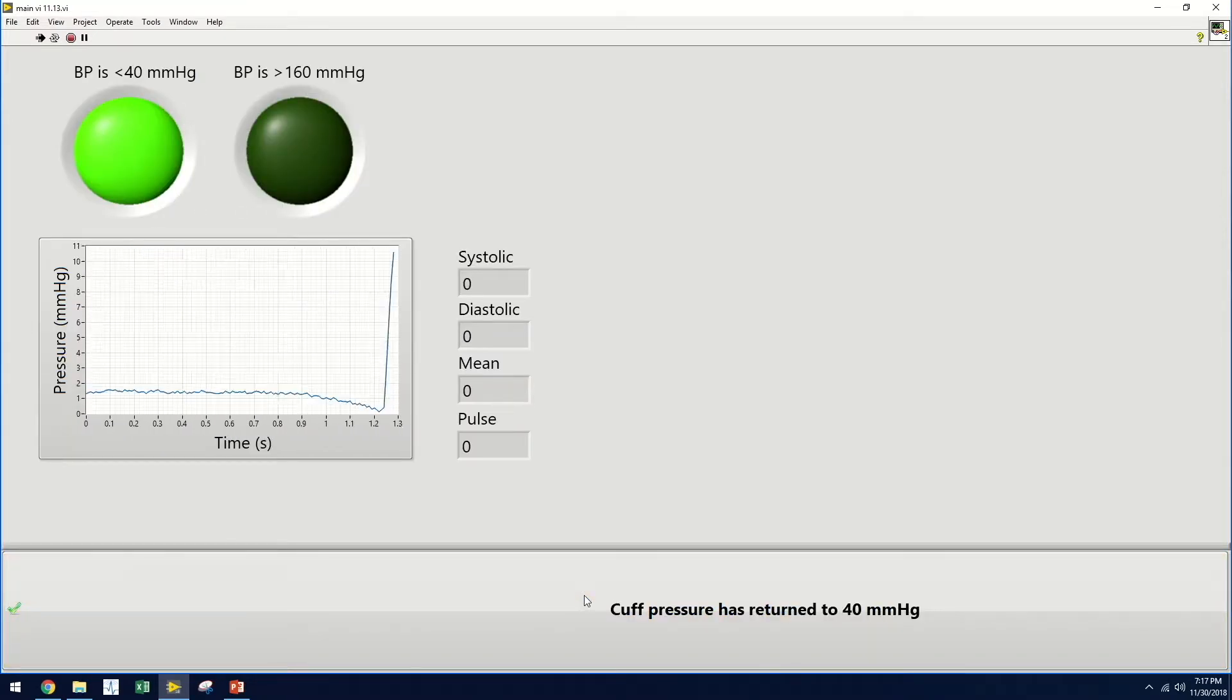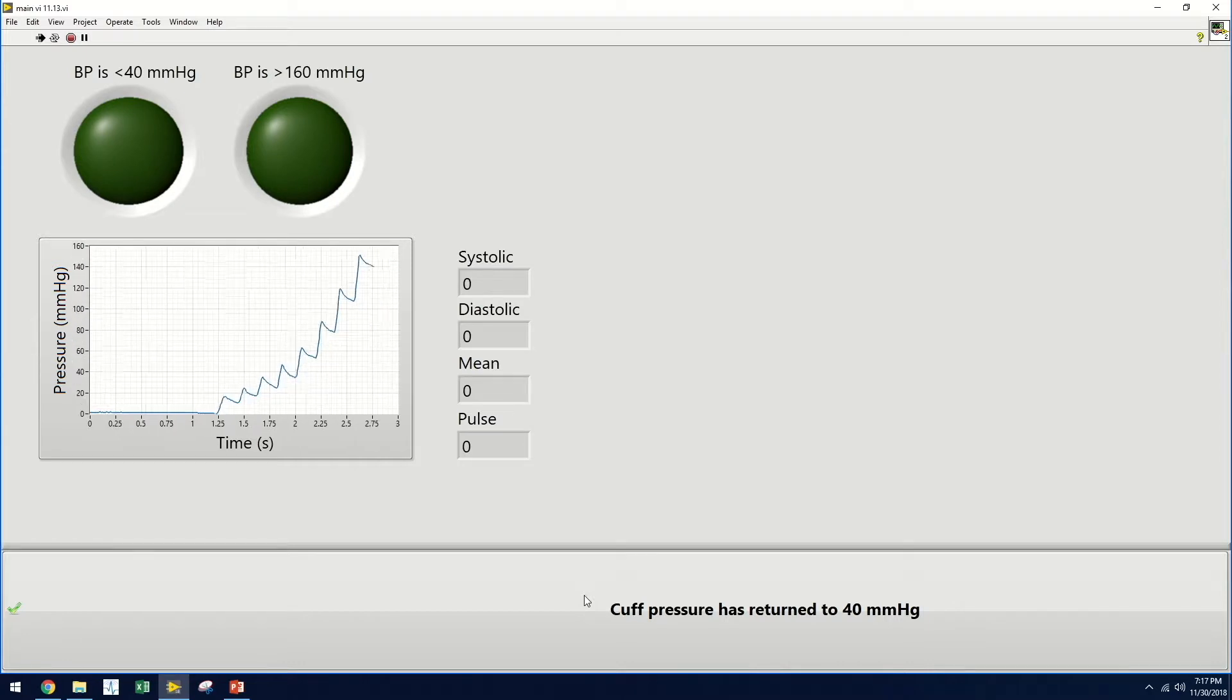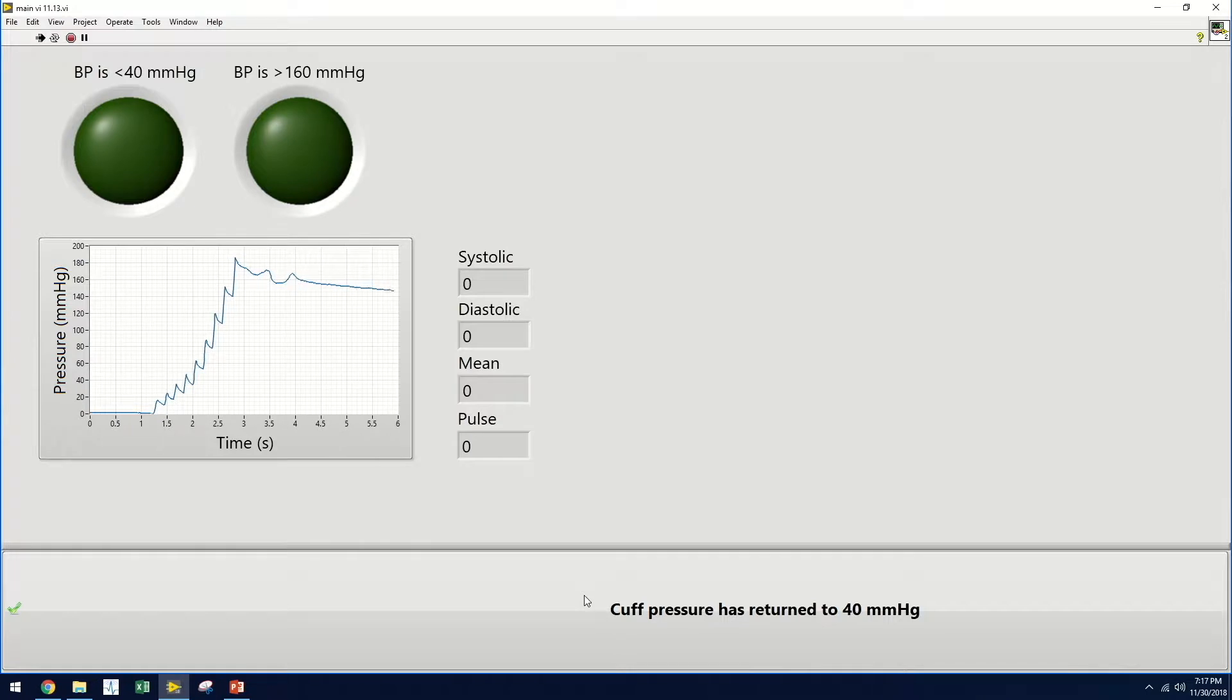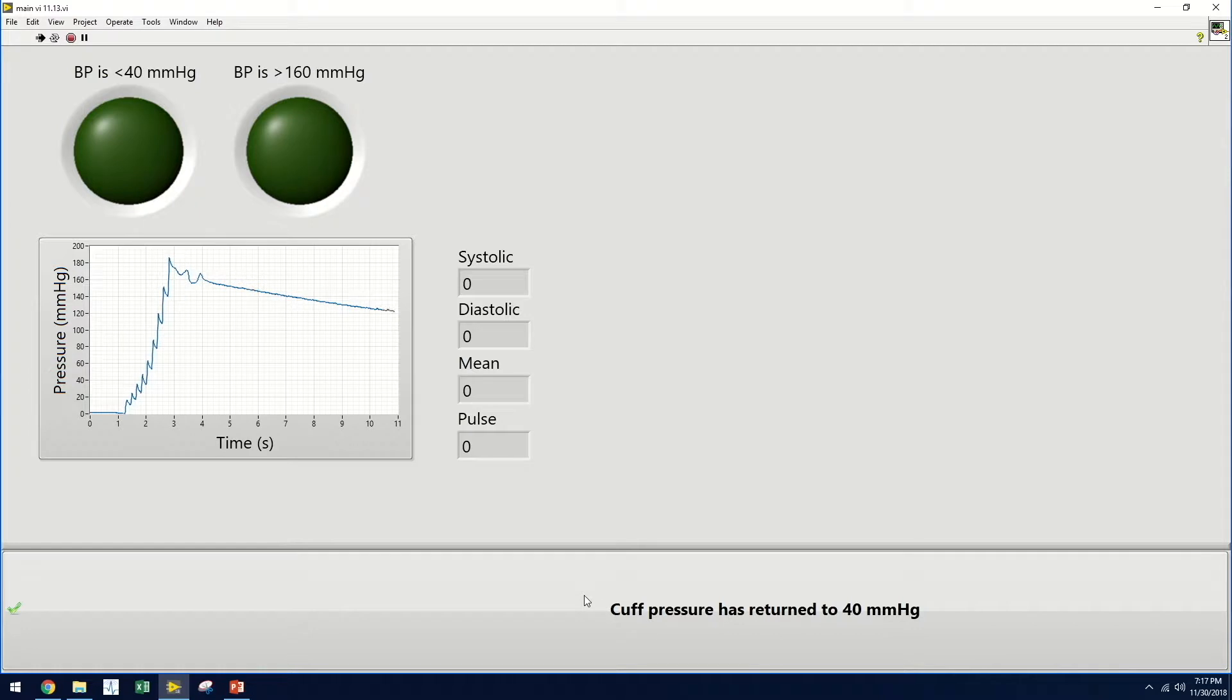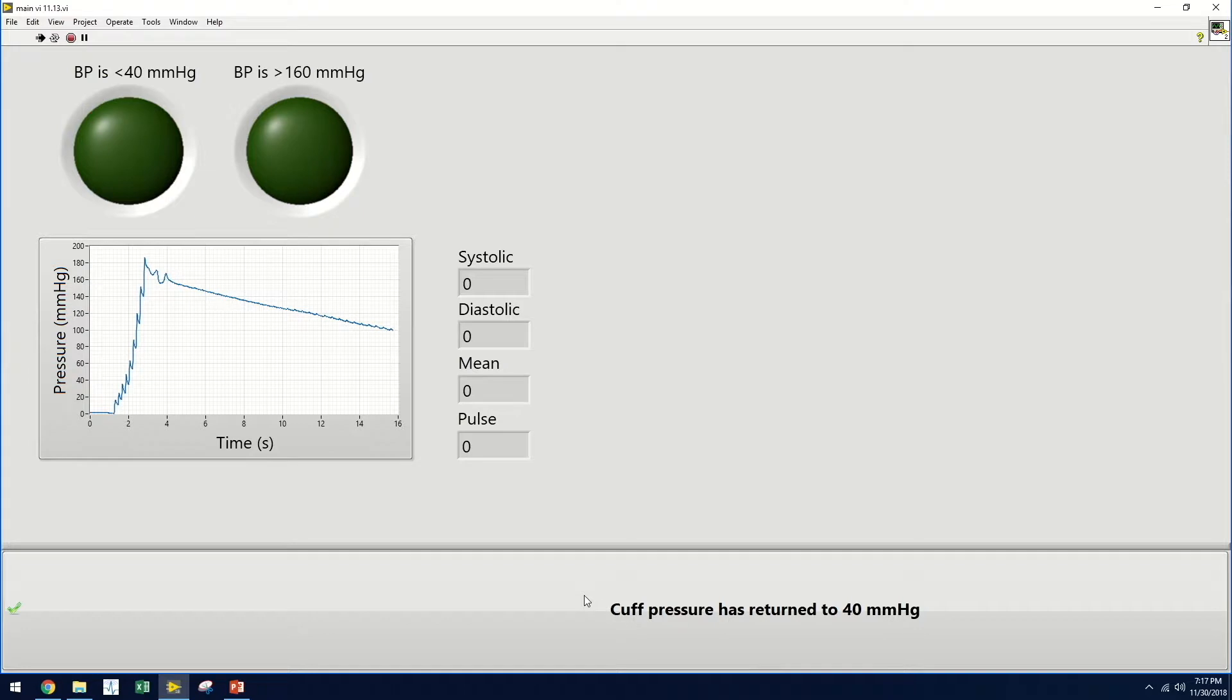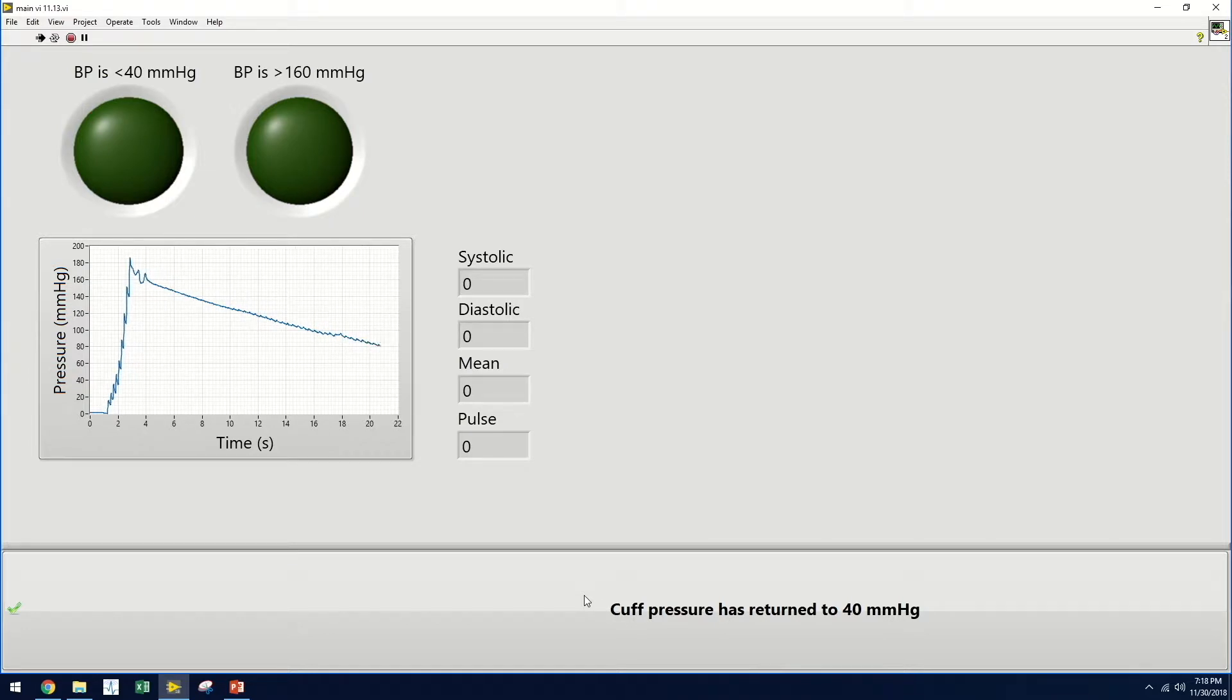Now the user can begin inflating the patient's blood pressure cuff. An LED will indicate when the pressure in the cuff has exceeded 160 millimeters of mercury and the user may stop inflating it. Once this occurs, a second LED will eventually indicate when the pressure has returned to 40 millimeters of mercury. The user will then click the button at the bottom of the screen to indicate that the pressure has returned to this level and the blood pressure information will then appear to the user.